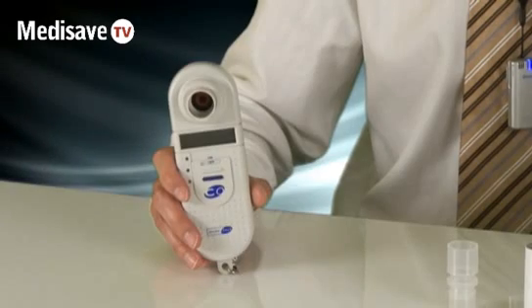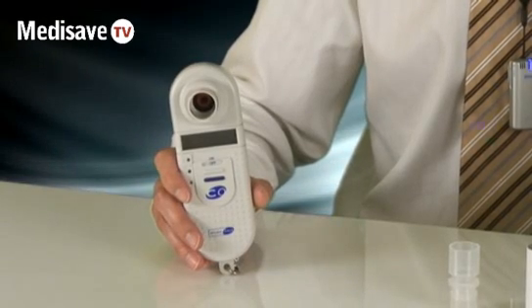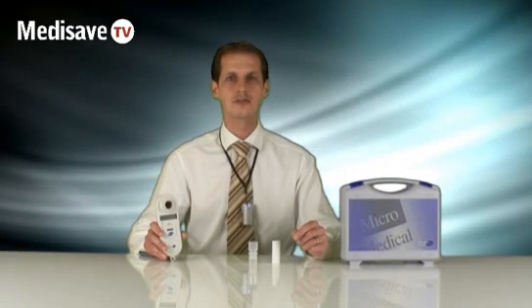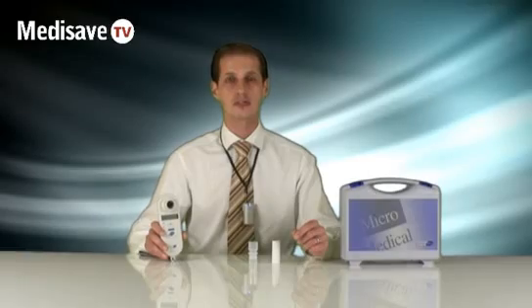Welcome to the MediSave demonstration of the Micromedical SmokeCheck device. SmokeCheck measures CO in parts per million and is used in smoking cessation clinics. It's very simple to use.